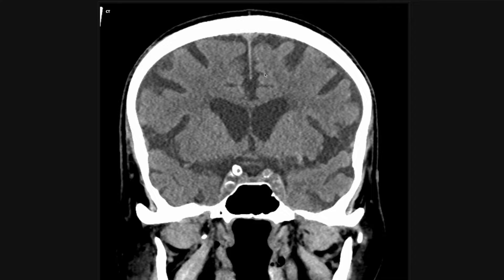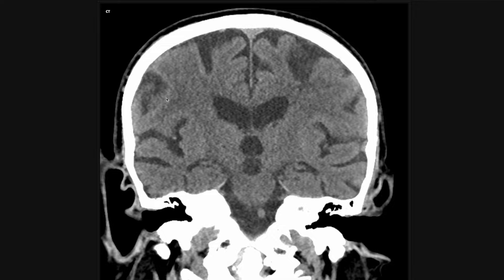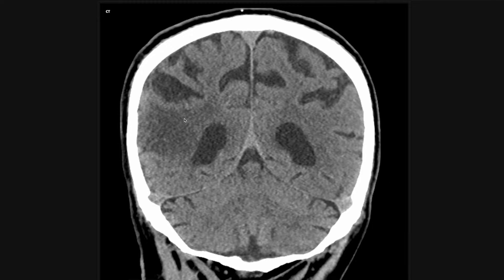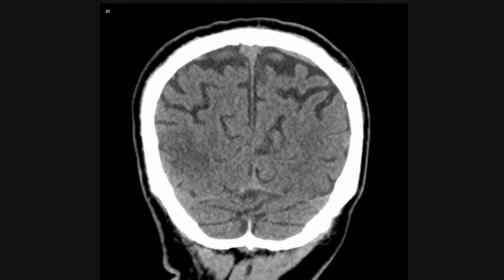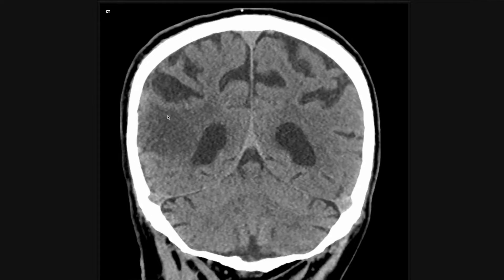This next case is a companion to the first one — the pathology is on the right. I talked about the loss of gray-white differentiation. In an acute stroke, you lose the normal difference between the cortex and the subcortical white matter. The white matter is darker; the cortex outlines the white matter and is much more dense. As I scroll through here, going anteriorly I don't see anything, but going posteriorly — right here — you can't really differentiate the cortex from the white matter. This is a finding of infarcting brain: loss of gray-white differentiation due to cytotoxic edema, causing the gyri to swell and sulcal effacement. This patient has an acute right middle cerebral artery territory infarct.